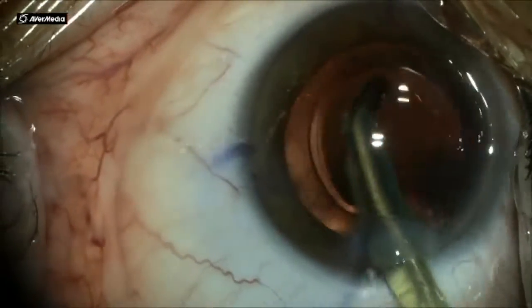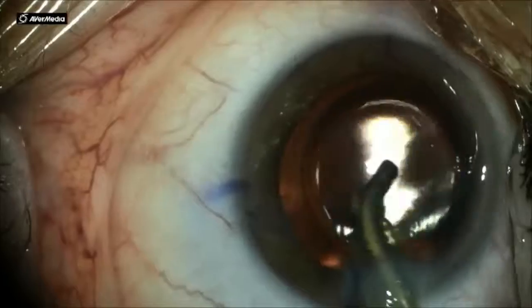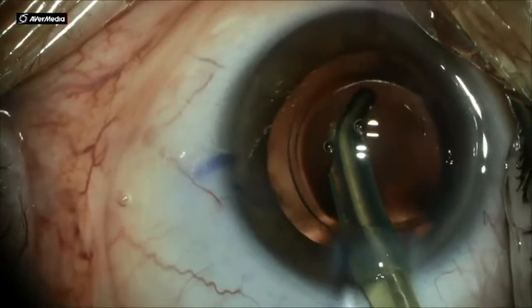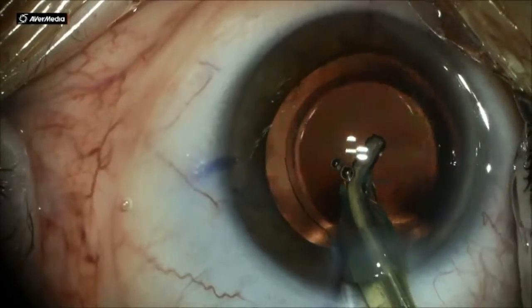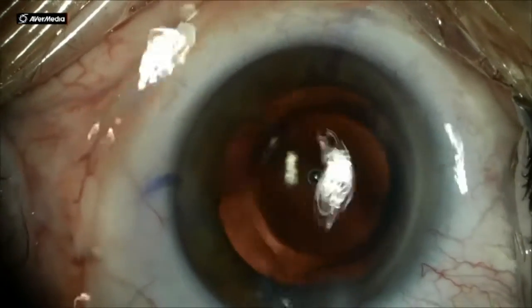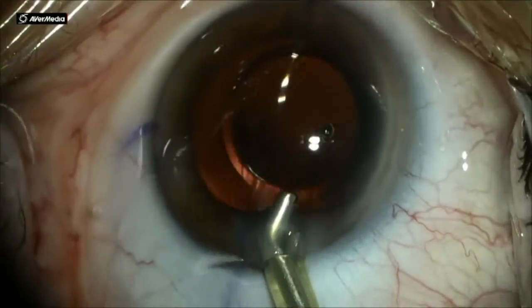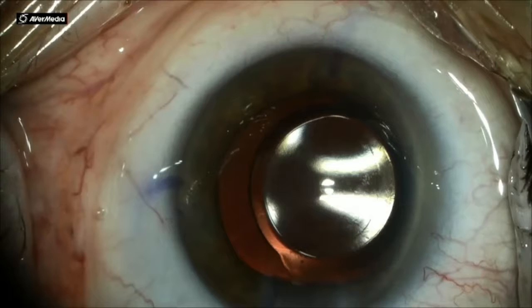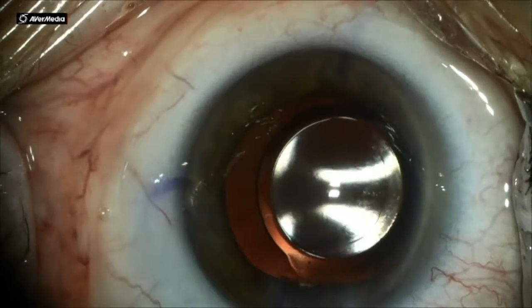To make sure that all of the OVD is removed from the equator of the capsule or bag, and that there are no remnants of any cortical material which may potentially cause an asymmetric collapsing or asymmetric phimosis of the capsule. If you have any doubt, go back in and remove all of the OVD.